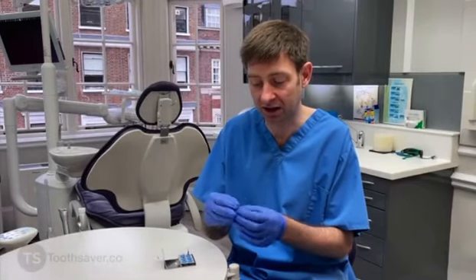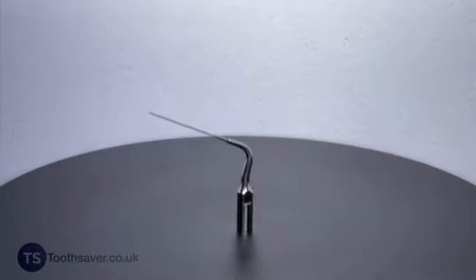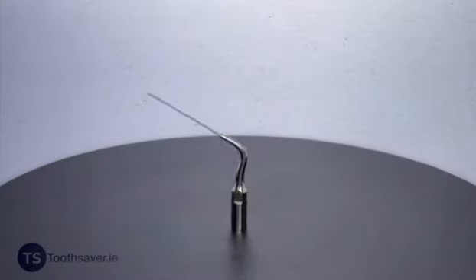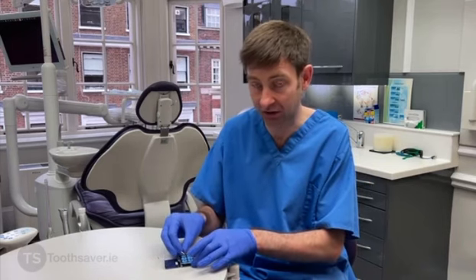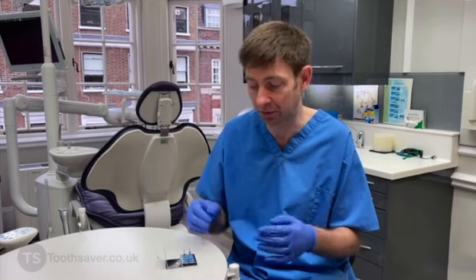The first one is for troughing between canals. Or if there are two canals that are very close together in an isthmus, you can use this tip to open up between the isthmuses and to make sure that our irrigation penetrates deeper down. Once the canals are fully prepared, we have three tip options.